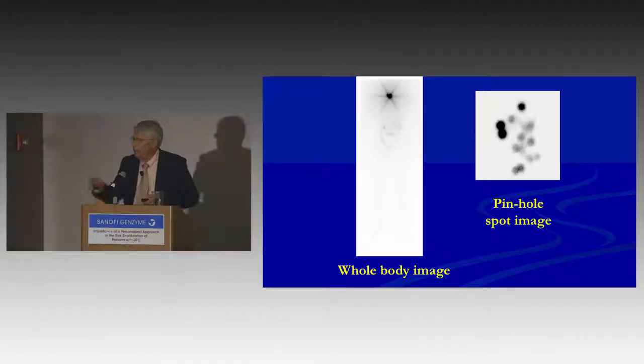That's a pinhole image, 1, 2, 3, 4, 5, 6, 7, 8, 9, 10, 11 foci. Ultrasound was negative in this patient. This was confirmed as local region metastatic disease. That changes management. That changes stage.